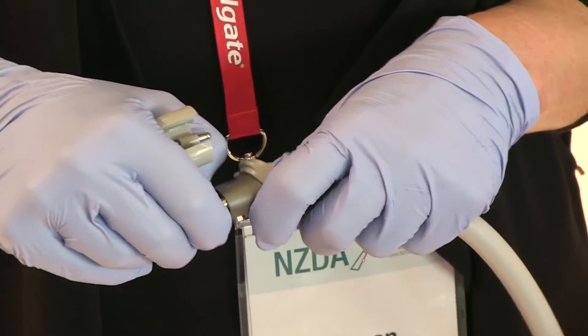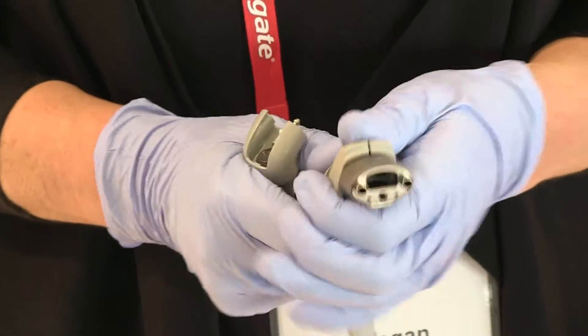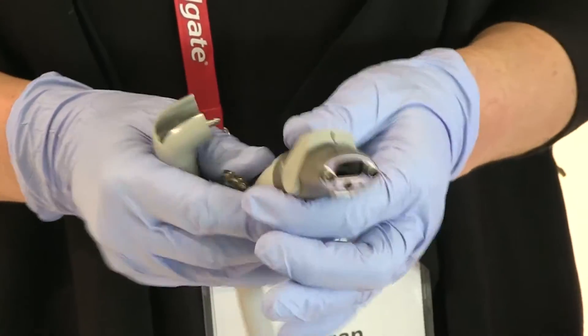This is a light guide, which is really the microprocessor — this is the brains of the whole piece. It's completely silicone molded, so it's safe in terms of sterilization and management, and it has a titanium head.